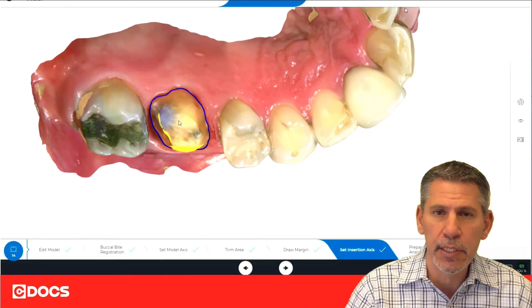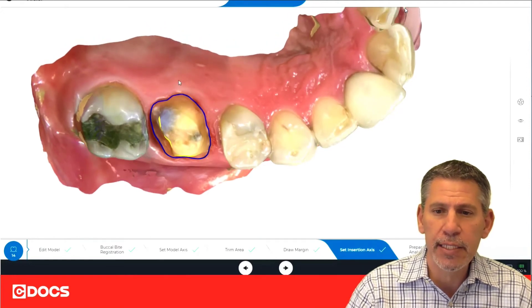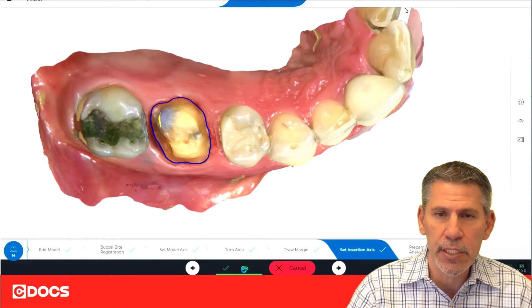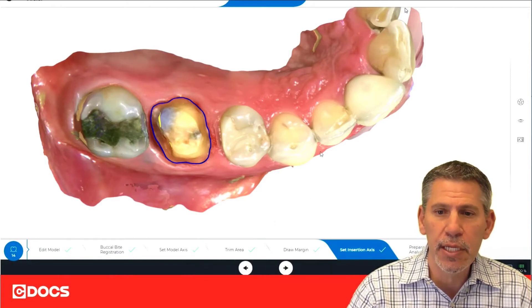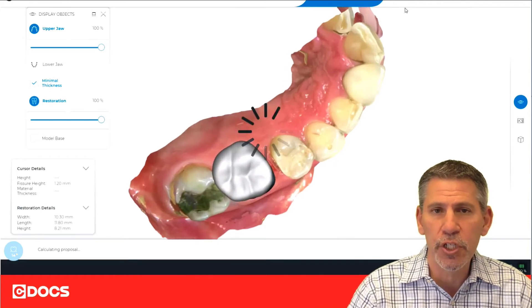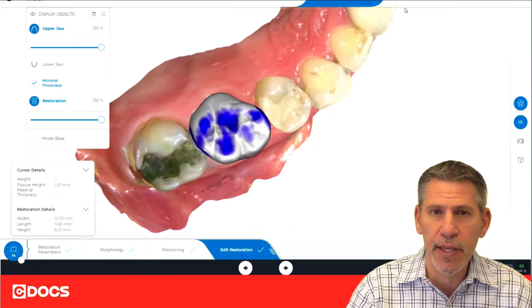Here's where the problem happens. Even though this is an automatic step, sometimes that insertion axis can be off. We want to make sure that we're looking straight up and down — we want to see how the crown is going to seat on the restoration. By straightening that back up, you'll notice we are going to get a brand new proposal. So it's important to check this step before the design phase.